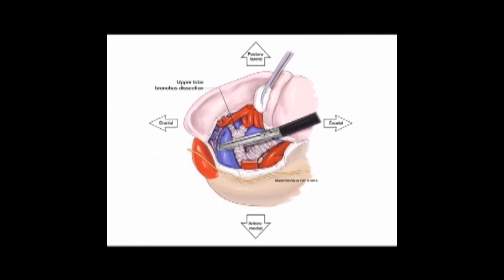Once you have stapled and divided the bronchus, you will find several small pulmonary artery branches remaining behind the bronchus going to the remaining left upper lobe. Those are merely dissected, encircled, stapled, and divided, leaving nothing holding the lung but the fissure. Since you started with a posterior approach and extended it apically inferior to the aorta, taking care to preserve the phrenic nerve and the recurrent laryngeal nerve and performing a mediastinal lymph node dissection, all that remains is the fissure division. The fissure is divided from an anterior approach through the utility incision. The left upper lobe is placed into an endocatch bag and removed through the utility port.